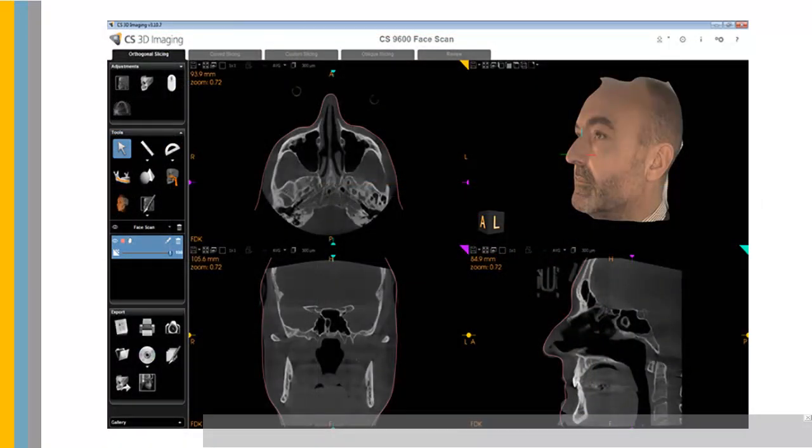When viewing in CS3D Imaging, you must align the image with the existing 3D volume.